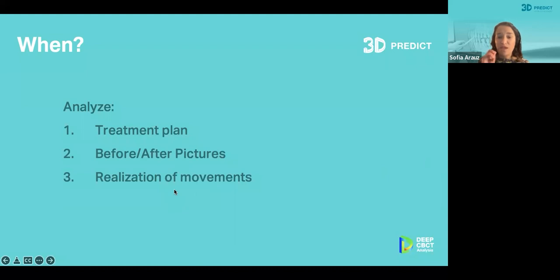So when an aligner does not fit, like I showed you in the previous slide, the refinement should take place right away. Please don't wait. If that aligner is not fitting, things are not going to improve. Let's just submit for our refinement, and I'll show you exactly what you need to do.